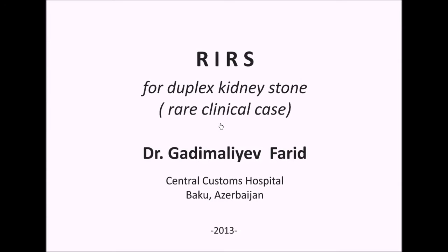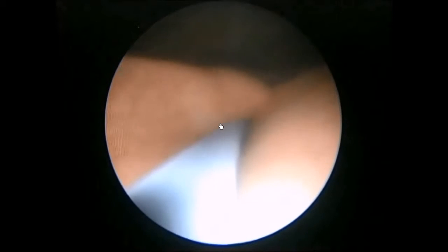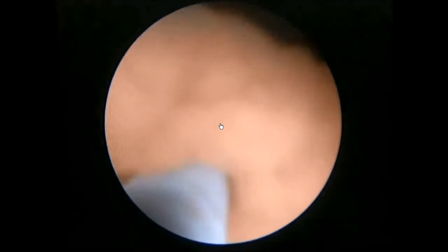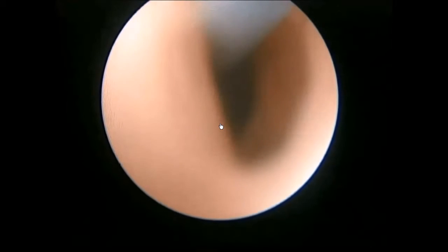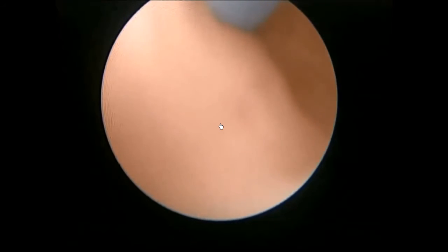In this video we present a rare case of retrograde lithotripsy in duplex kidney. Using an EIA flexible ureteroscope, you can see a guide wire being passed through the ureter to the left kidney.